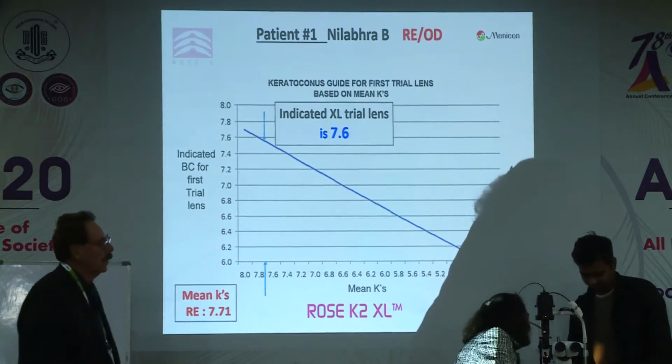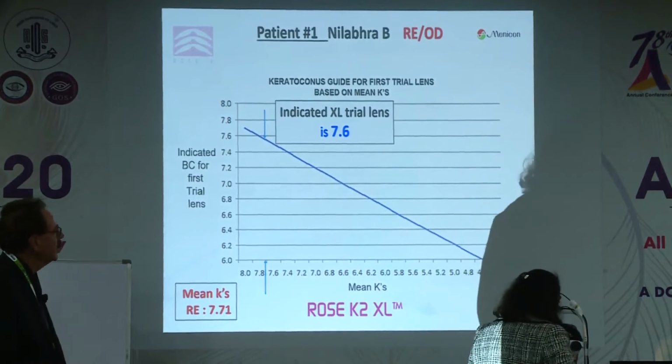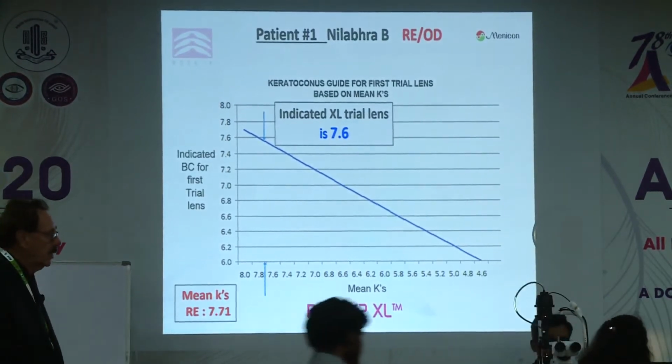Standard. This is standard edge, no? So all the trial sets, unless you specifically want them otherwise, are standard edge lift.